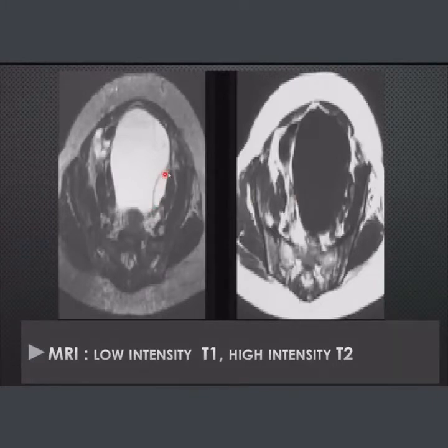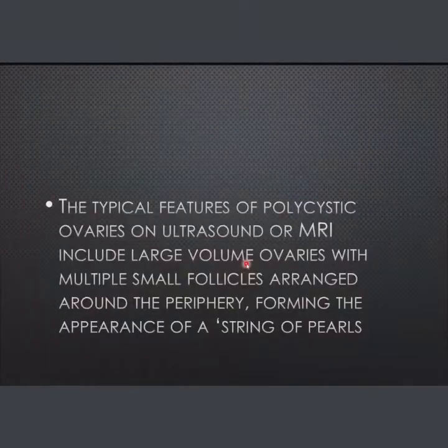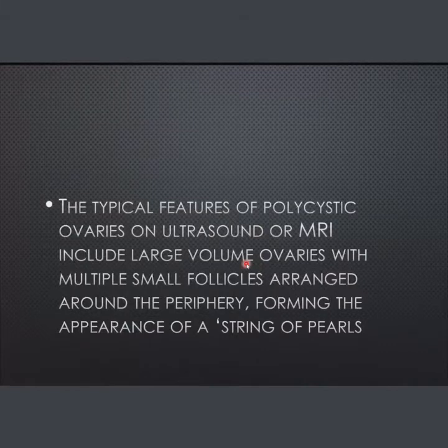Here we notice the presence of a thin septum. By definition this is not considered a simple cyst but a minimally complicated cyst. This is again a cyst, very bright in T2-weighted image, suggesting fluid content.